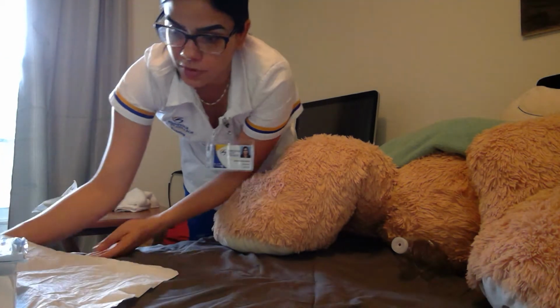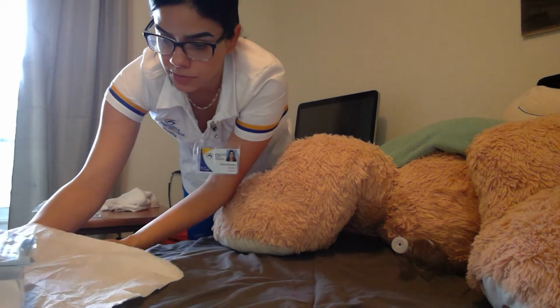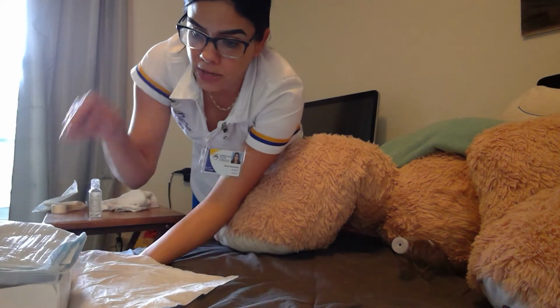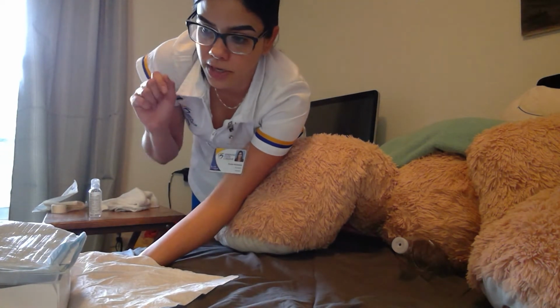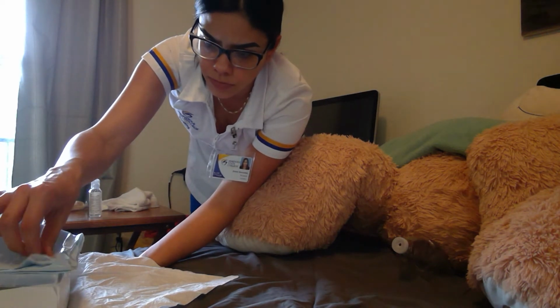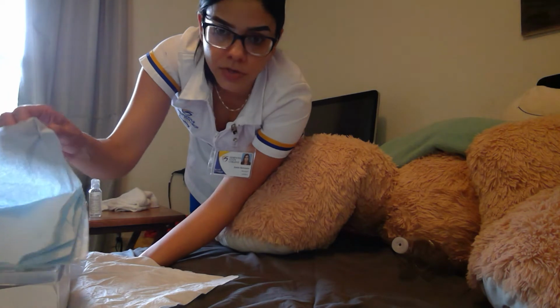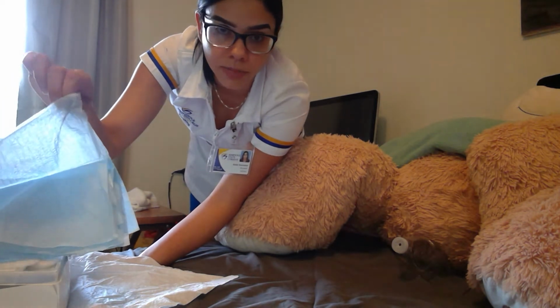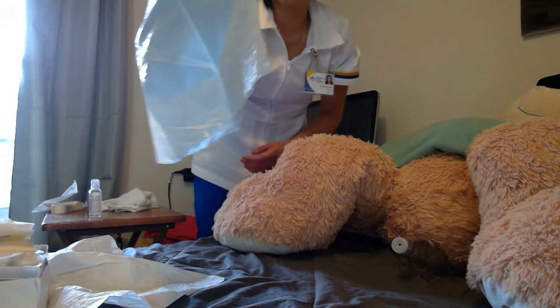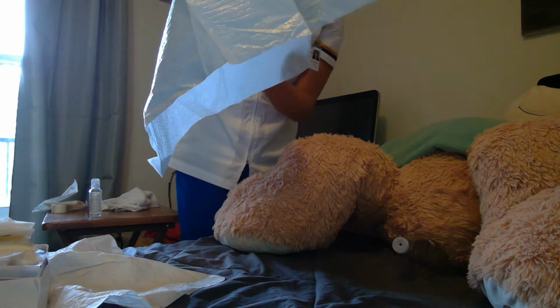Okay, my tray. And well, I need you to see that I am going to take my shiny waterproof drape from my shiny part here with one of the corners, making sure I don't touch it. I'm just touching my shiny part. Okay, and I'm gonna let it go down.